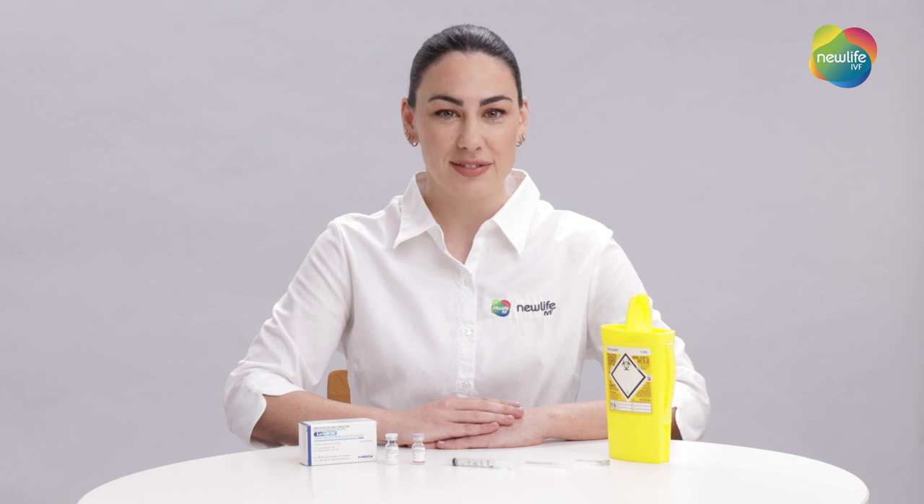Welcome to our New Life IVF medication video series. My name is Ruby and I'll be showing you how to prepare Levaris. Levaris is given for follicle growth and maturity as prescribed for you by your fertility specialist, and is generally given once per day as advised by your fertility nurse.